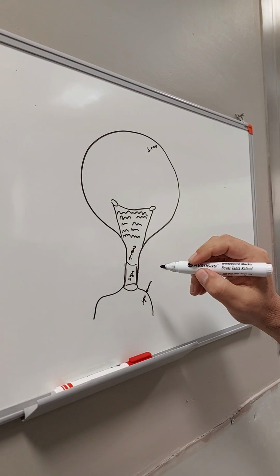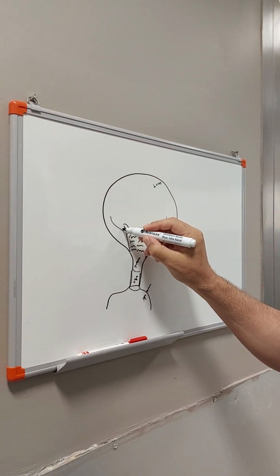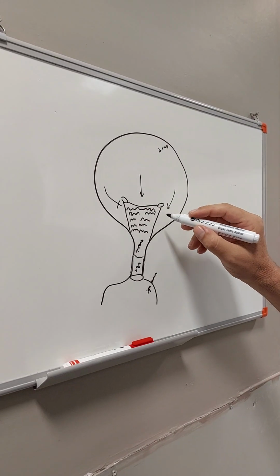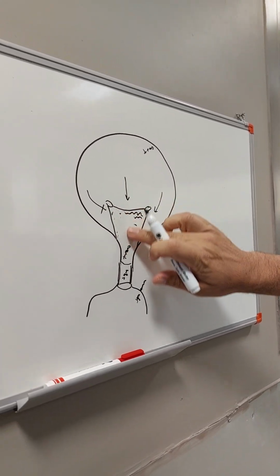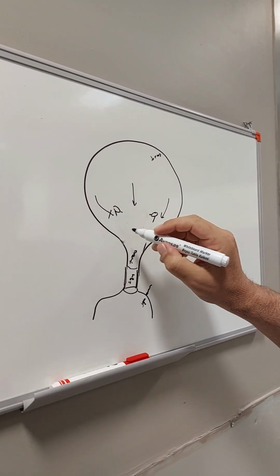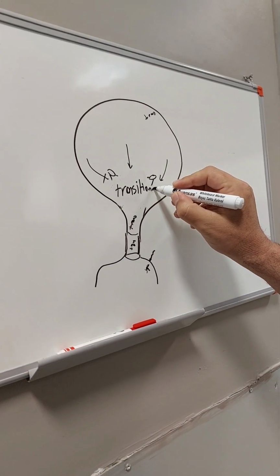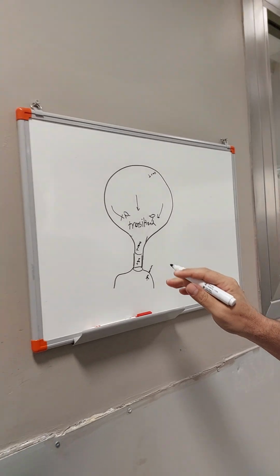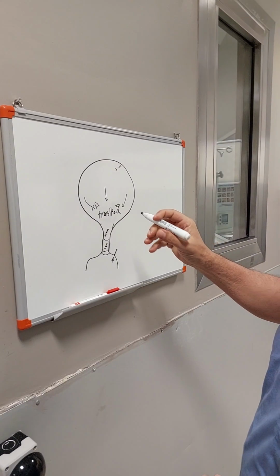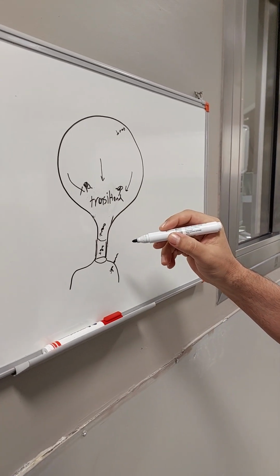When I fulgurate these tissues, newly coming tissues come from the side walls, and they are the same transitional epithelium like these side walls. They all cover, when I fulgurate these, okay, so they all unite together, and all of them are transitional now. And the tissue becomes infection resistant. Yes. So after noticing this, I was fulgurating this part, and it was healing.